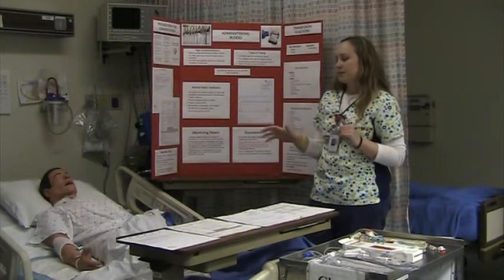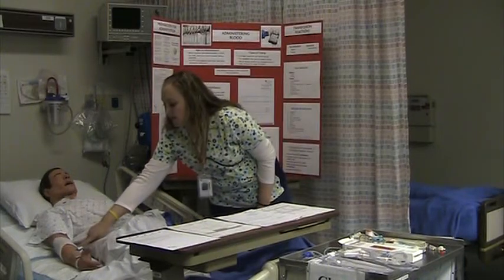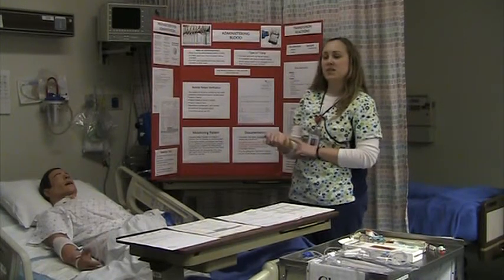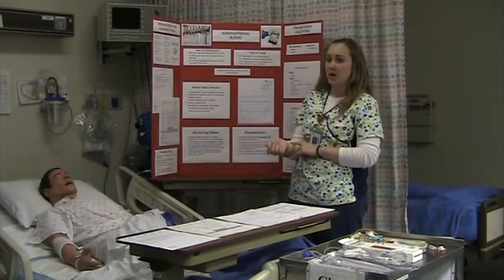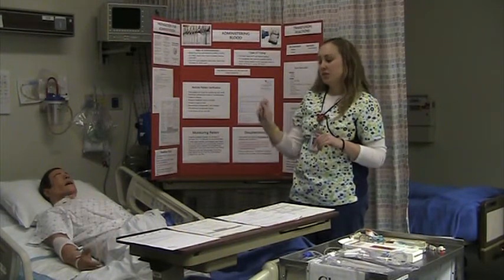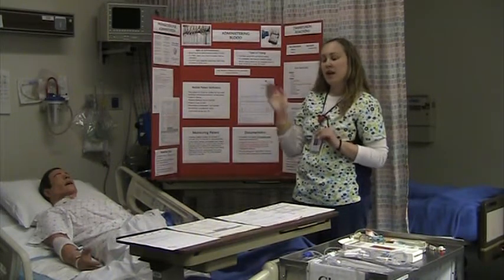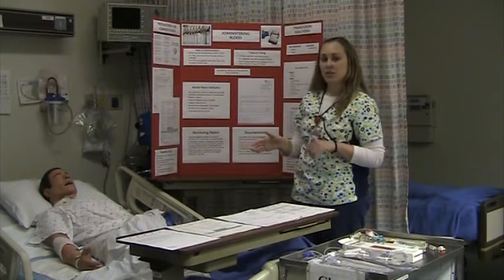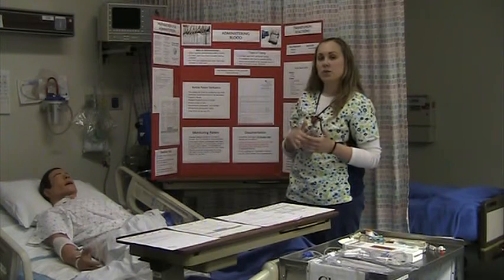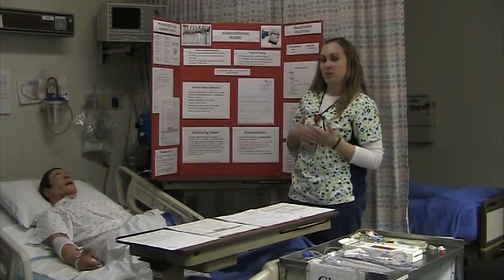We are then going to disconnect all the way up to the hub of the patient. You don't have to take out the IV, but the saline lock that is connected to the patient needs to be removed because that is filled with blood. All of that is going to go back to blood bank, and you're going to start a new saline lock and connect that with a new bag of normal saline and run that into the patient, making sure that patient safety is always your number one concern, so you're following the doctor's orders that you got after that reaction has occurred and taking care of the patient from there.